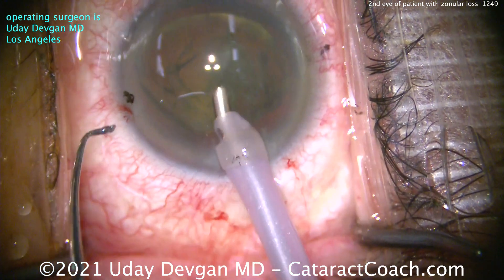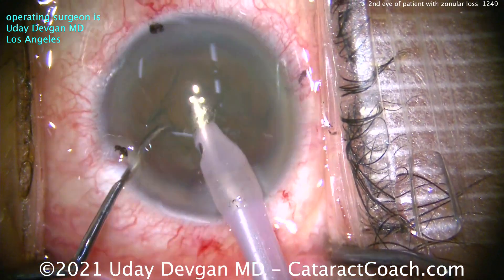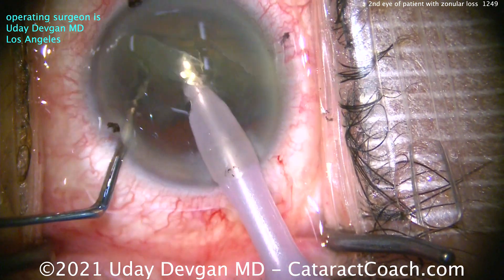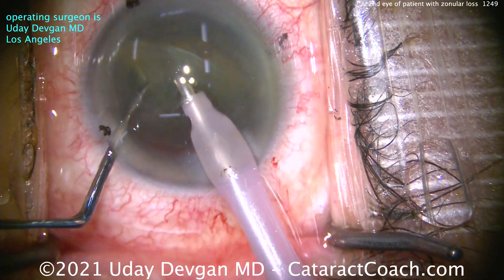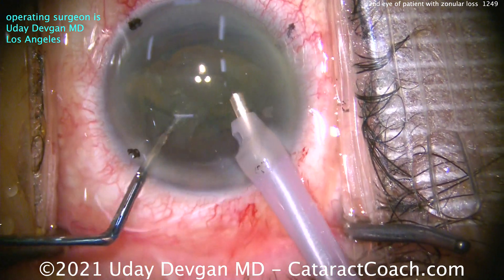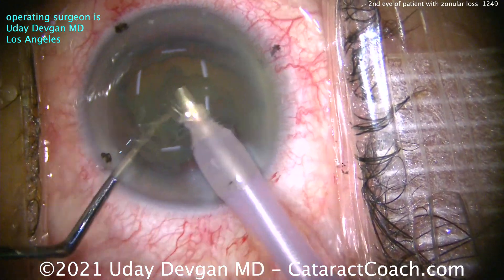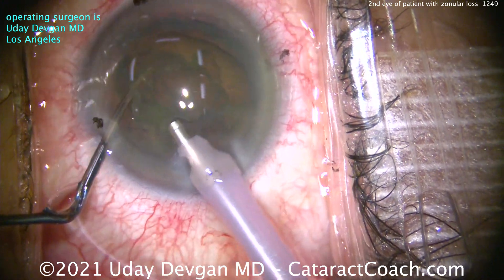Patients sometimes don't even recall having had trauma. So I ask: did you have any trauma? Your first eye was a hell of a challenge, I say, and the patient says no, I don't really recall any trauma — but maybe. That just tells me to be cautious. So same thing here — I'm slowing it down, being extra vigilant as I take out this endonucleus, looking around, making sure I don't see too much movement in the lens capsule or any really clear red reflex. It's not a dense cataract, not a difficult case.